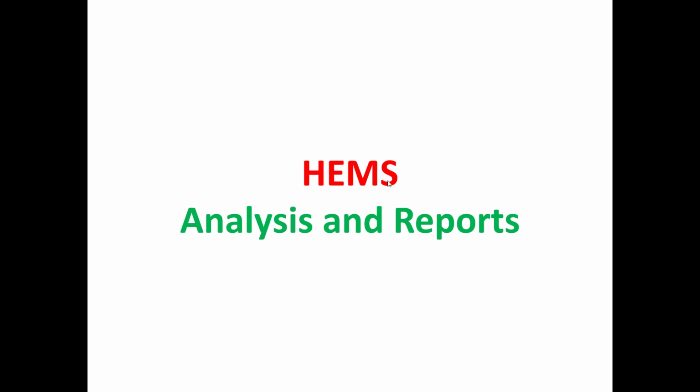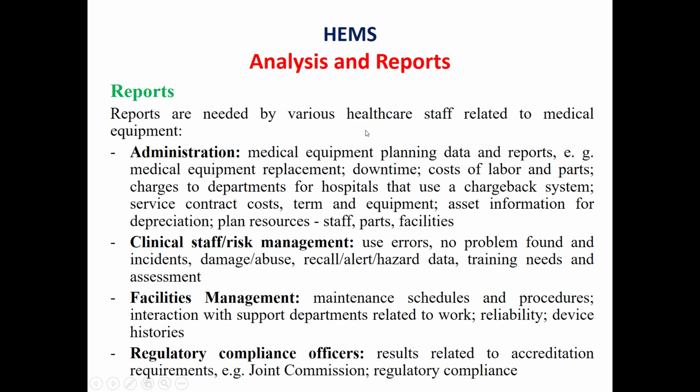Now we'll talk about the last point, which relates to the maintenance information as well as the medical equipment inventory, which is the analysis and the reports, which is the idea behind the computerized medical equipment management system.